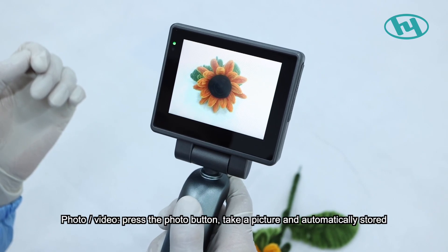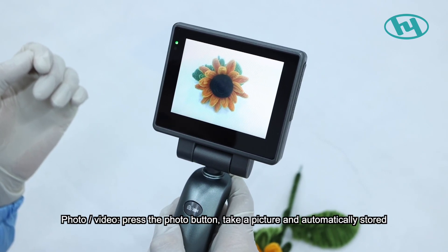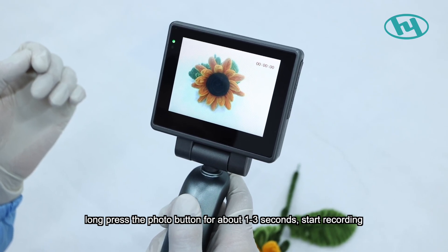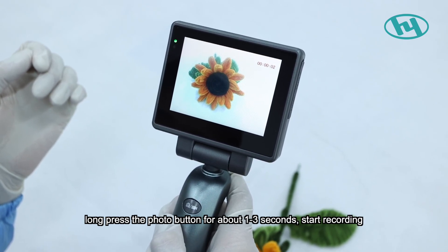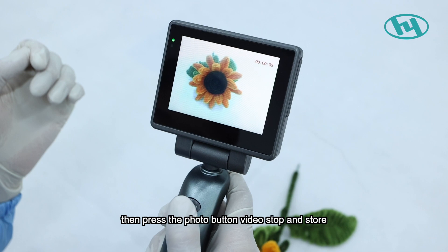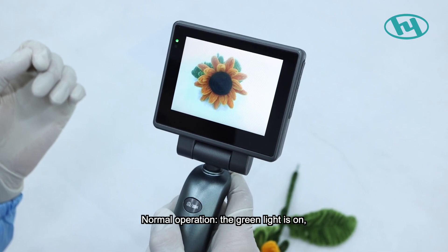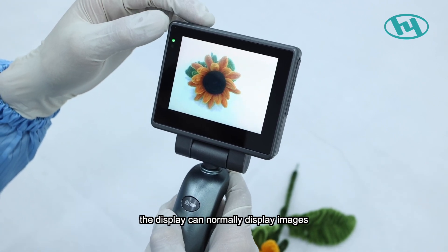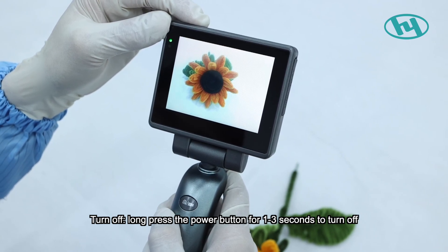To take a photo, press the photo button and the image is automatically stored. Long-press the photo button for about one to three seconds to start recording; the screen shows the video length. Press the photo button again to stop and store the video. During normal operation, the green light is on and the display shows images normally.